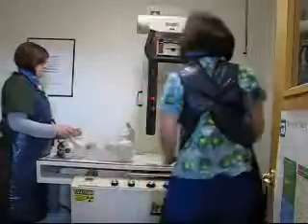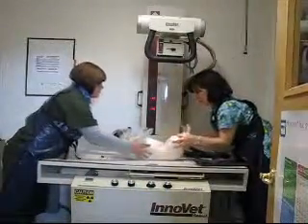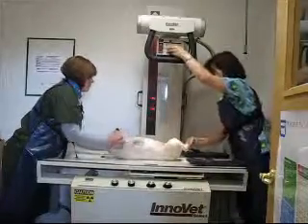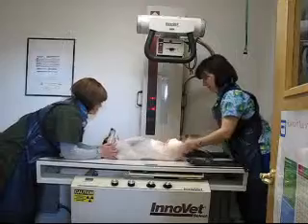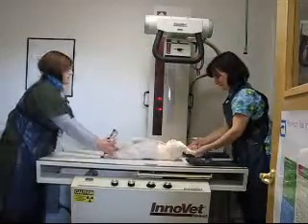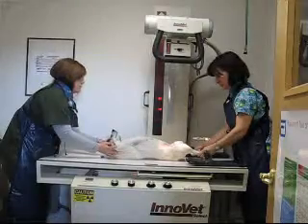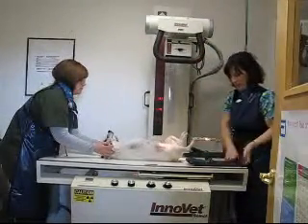Turn it up. Put my light on. Make sure I've got her collimated down. Straighten her knees. Pull this down this way just a little bit. Get her knees in too. Put my gloves on.